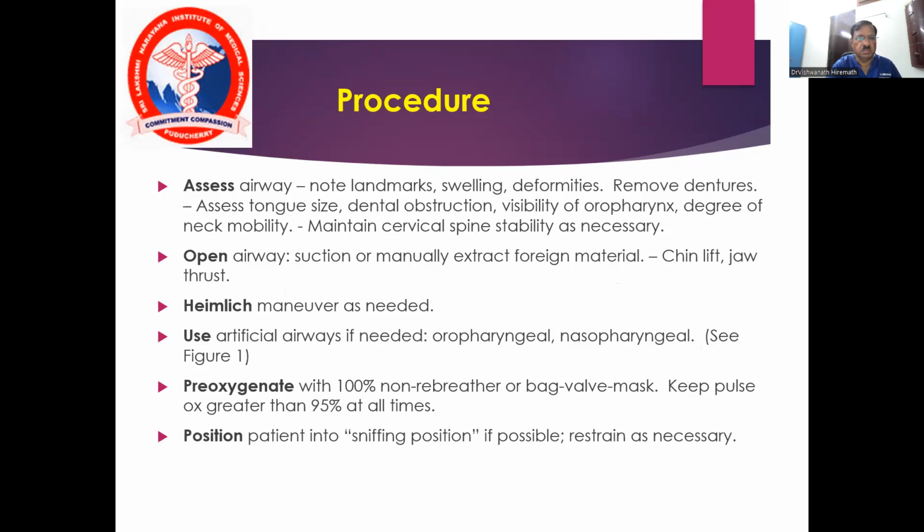Procedure. First, you have to assess the airway.